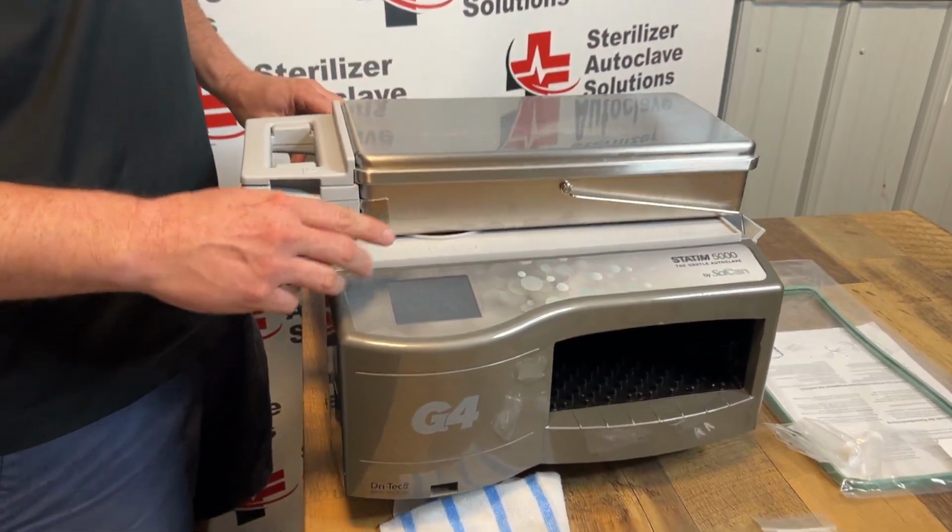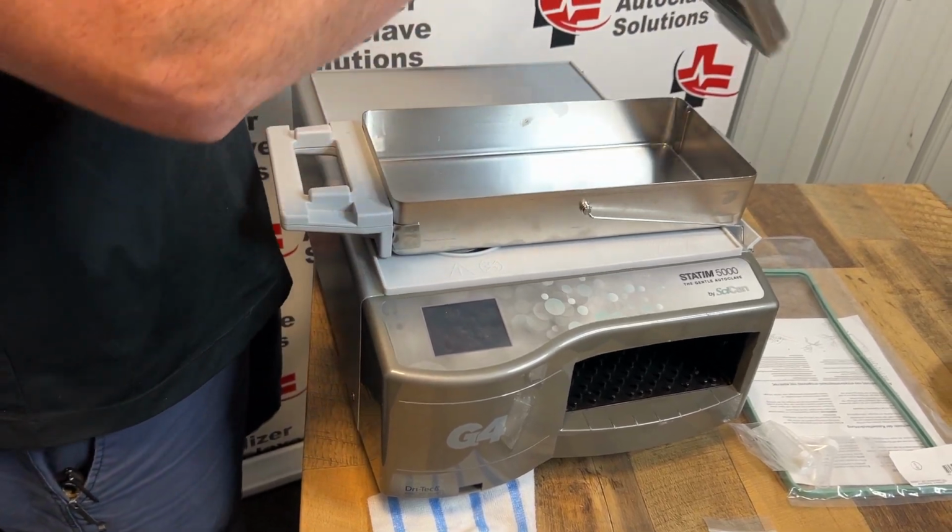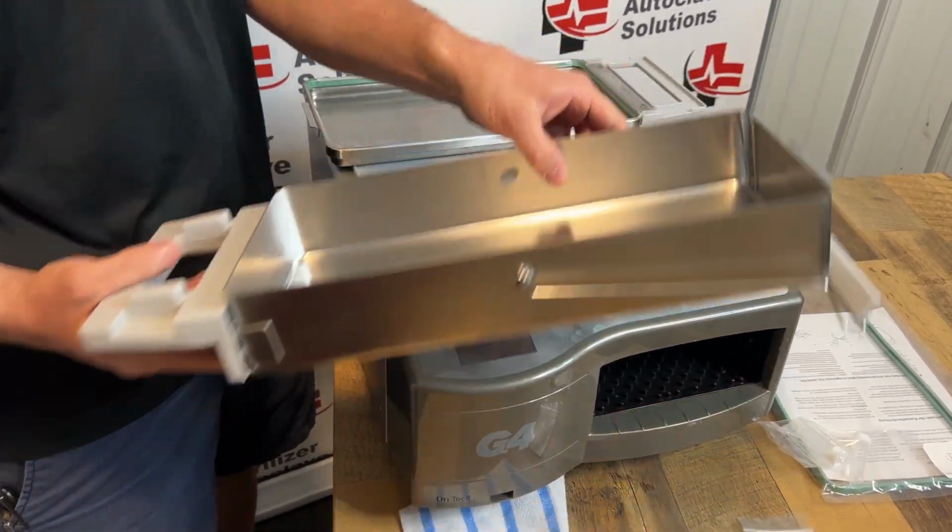First, I'm going to remove the cassette. I am putting the cassette on top of the unit, but I have a stat mat here, so I'm not going to scratch the paint. First, what I'm going to do is remove the top from the bottom.